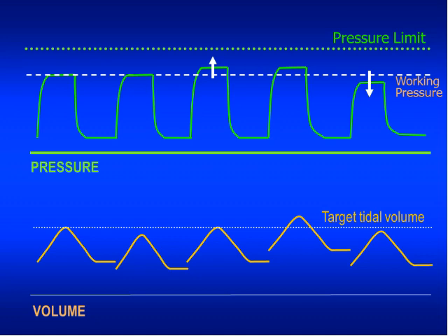But now the tidal volume falls a bit short of our target, and therefore for the next inflation we will have a step up in the inflation pressure. If that results in a tidal volume within a couple of percent of target, no change will occur on the next cycle.